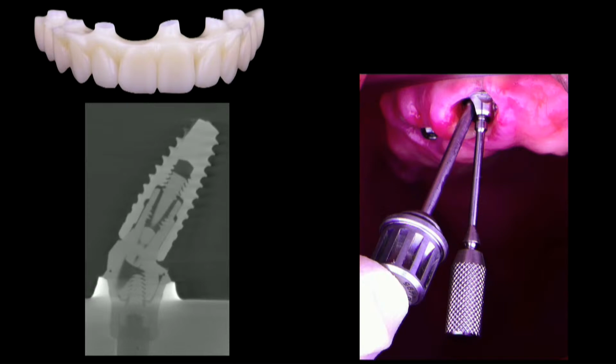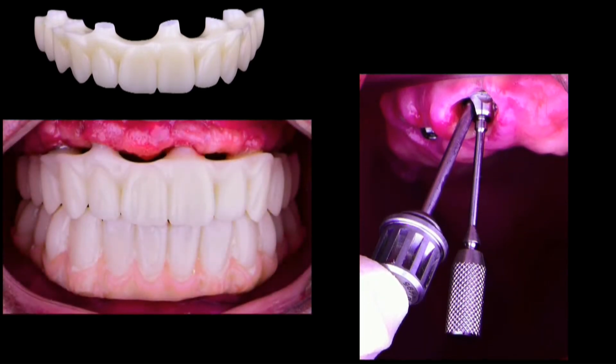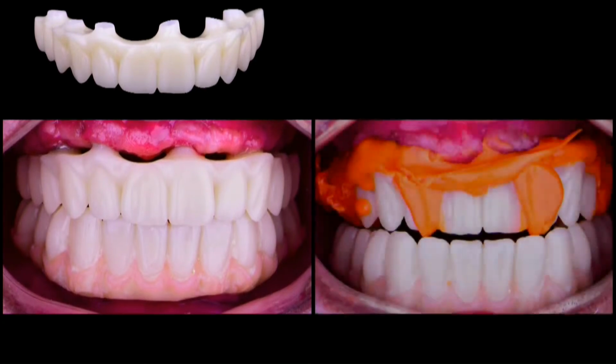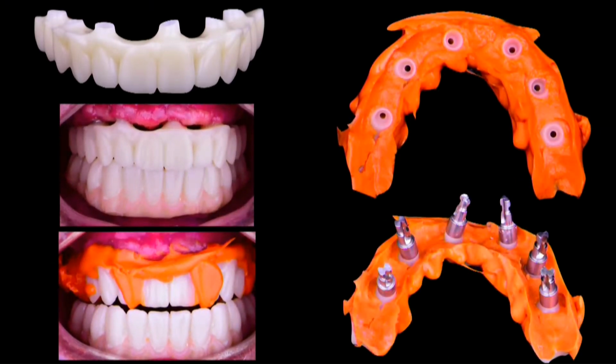Go ahead and secure the multi-unit abutments in the patient's mouth and secure the prototype. Now you can see that we have a space which I already intentionally planned in the software and in the design. This space will help me capture the soft tissue using a wash impression. So more or less now we have a very accurate final impression. We have all data needed. We have the position of the implants, soft tissue topography, teeth position, and even occlusion.